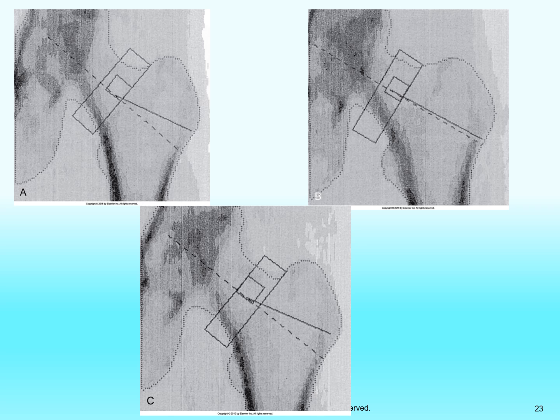You should understand that C was done just like A. B does not look the same as letter A. The difference is internal rotation or external rotation of the toe.